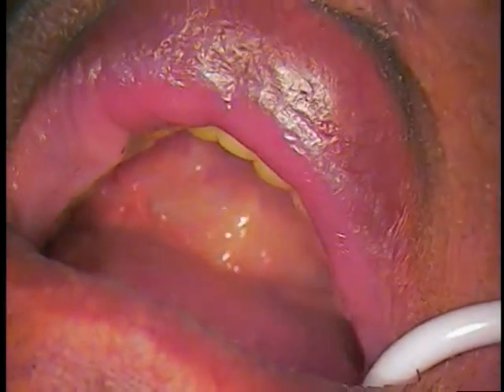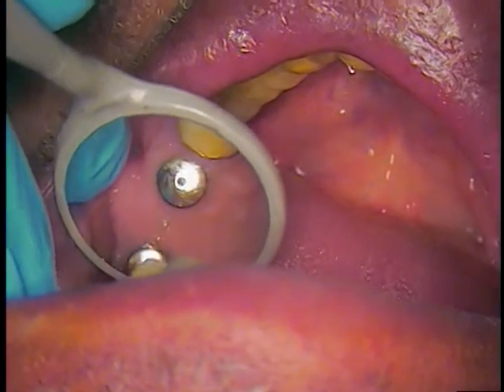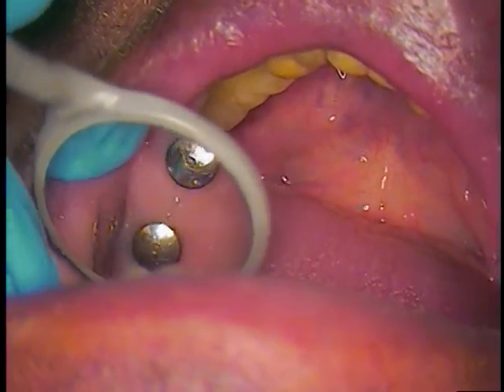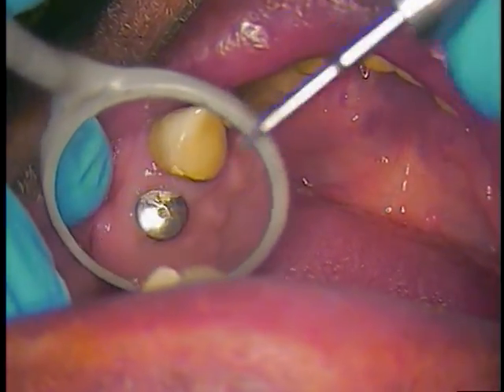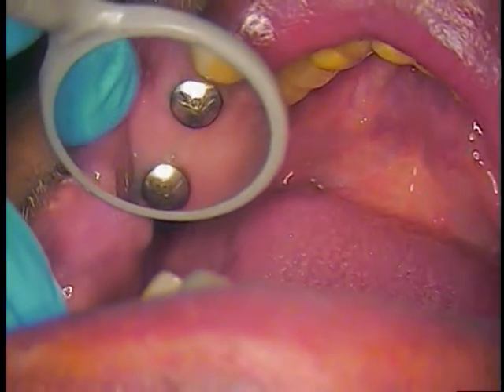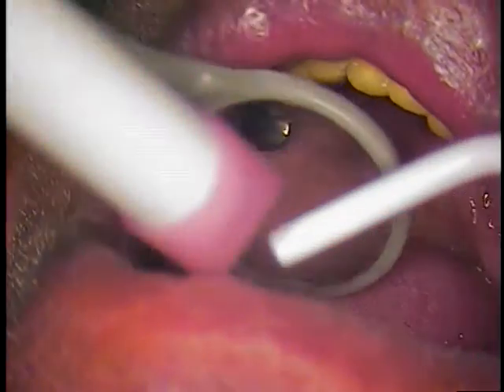So here we are directly in the mouth. There are healing abutments — gingival formers, as they call them. There's always a little bit of food particles that have to be removed, so we'll do that first.